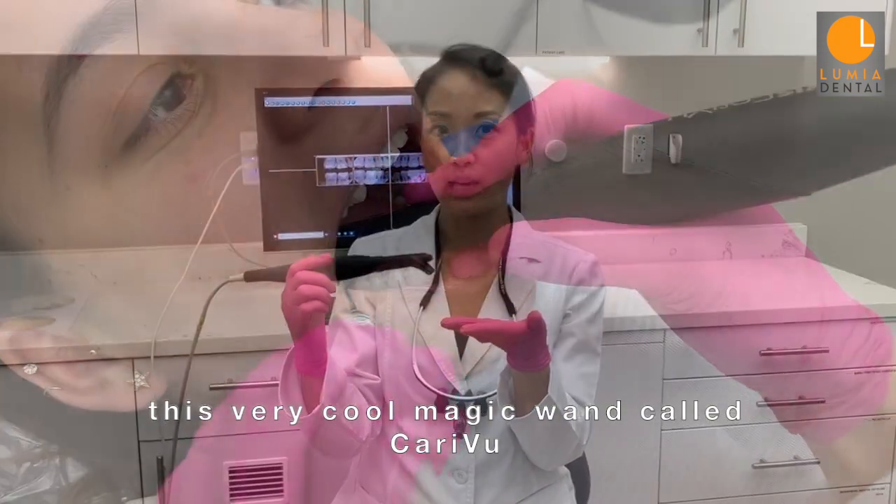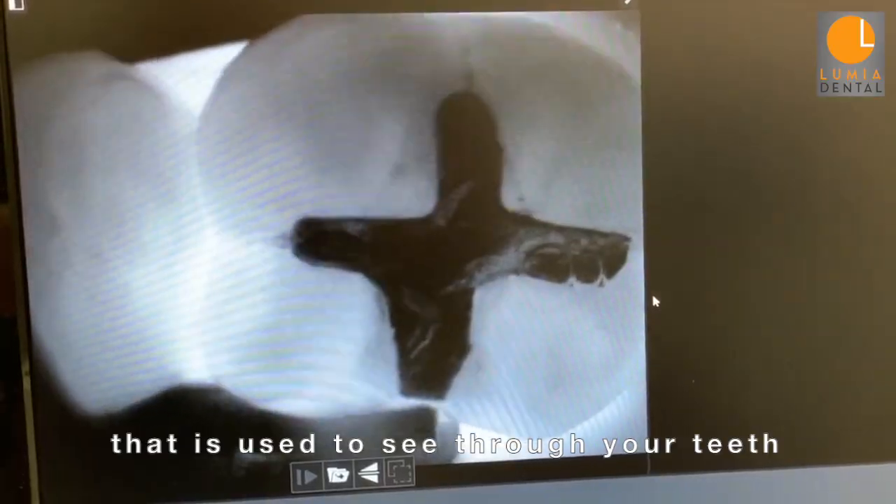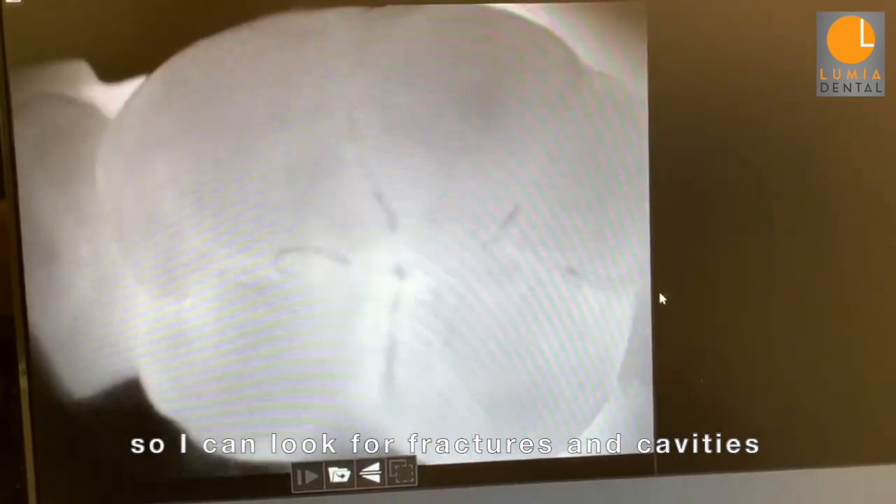Hi guys, this is Dr. Michelle Hanna, Lumia Dental, and today I'm going to talk to you guys about this very cool magic wand called CariVu that I use to see through your teeth so I can look for fractures and cavities because teeth are translucent. Let me show you.